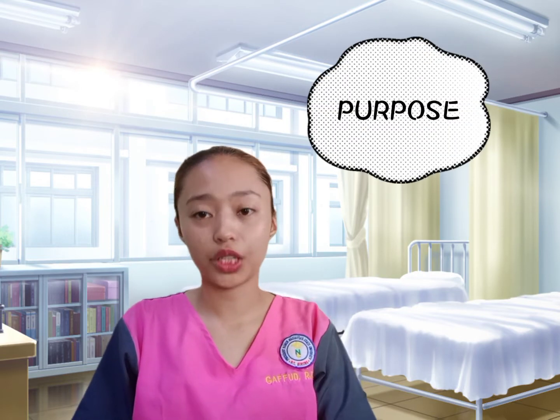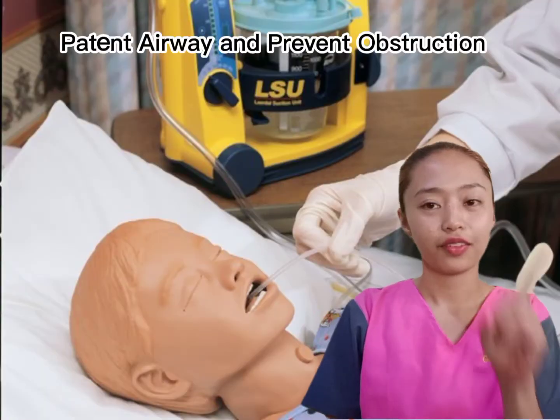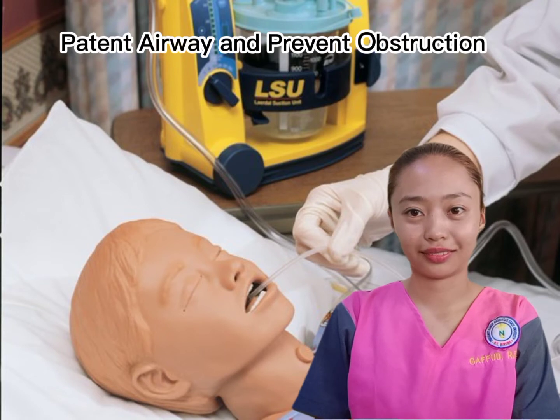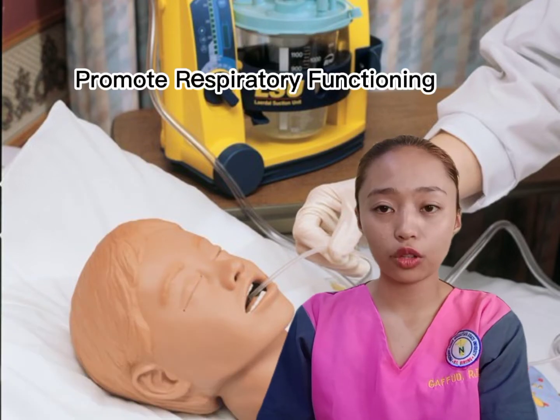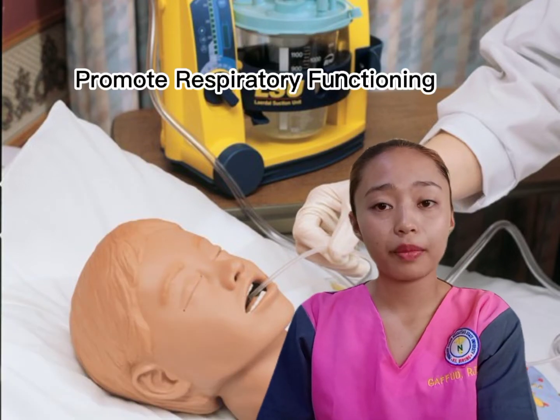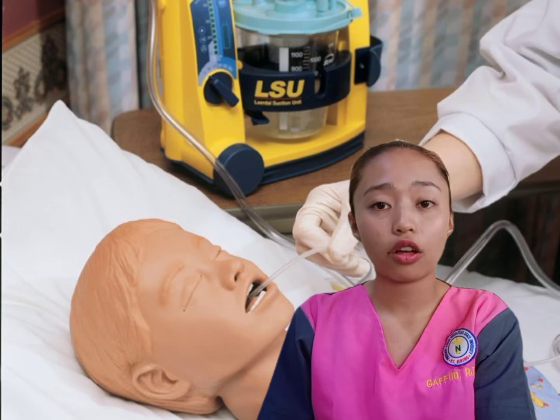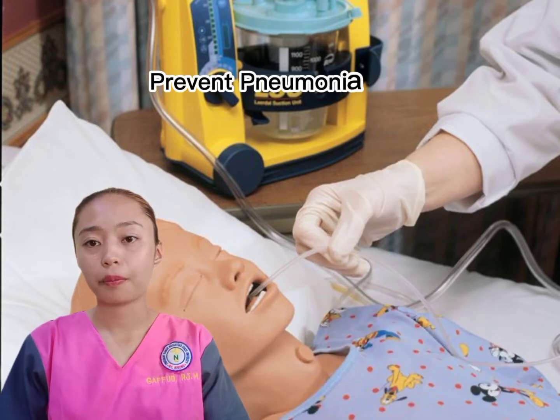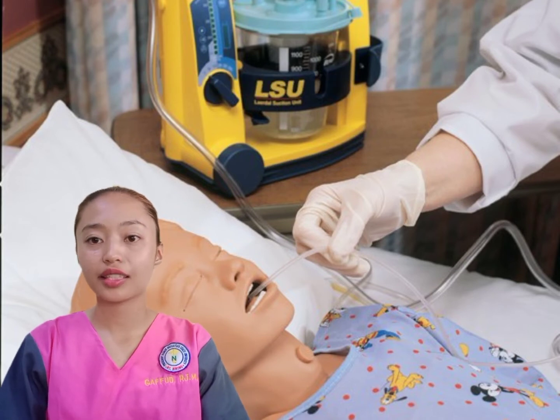What is the purpose of this procedure? First, to maintain a patent airway and prevent airway obstruction. Second, to promote respiratory function, optimal exchange of carbon dioxide and oxygen in and out of the lungs. Third, to prevent pneumonia that may result from the accumulated secretions.